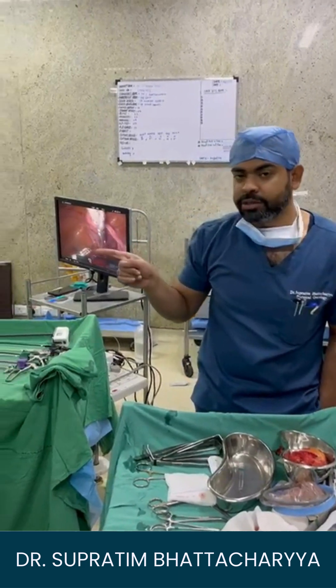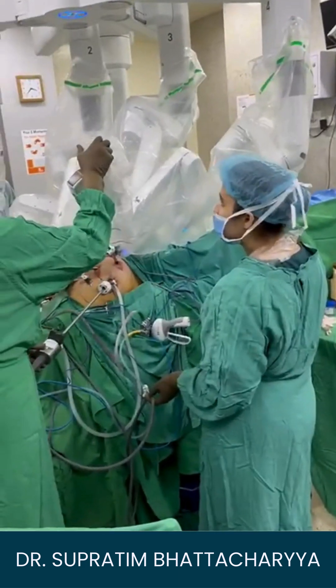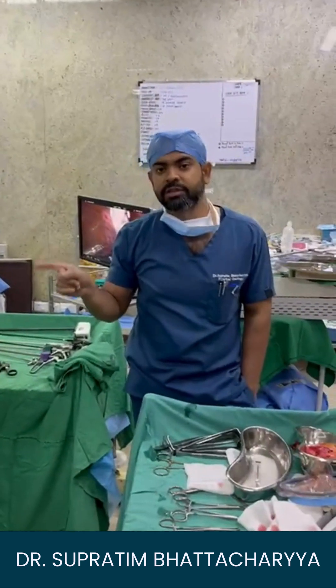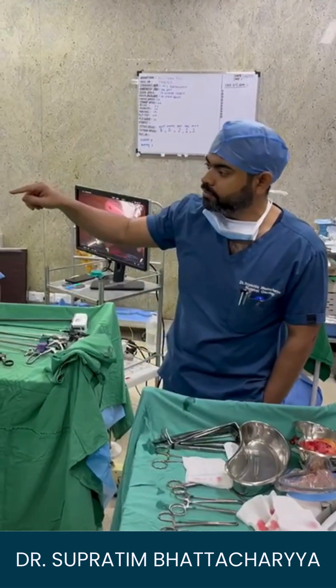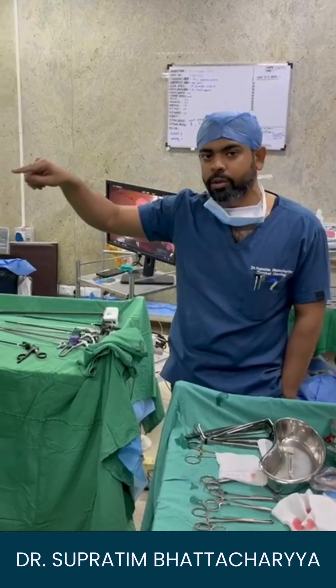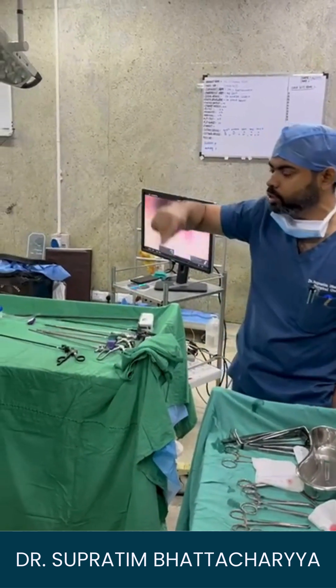In this patient, we are planning to do a robotic low anterior resection. For that, we have put all the robotic arms inside the patient's abdomen.